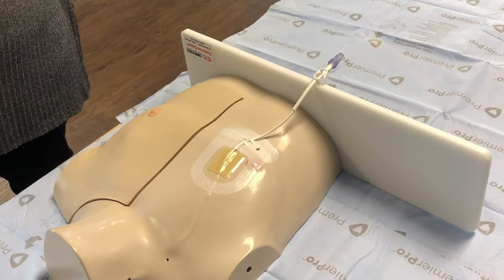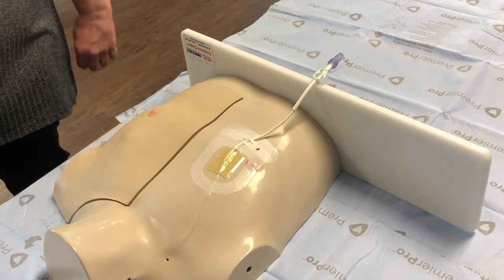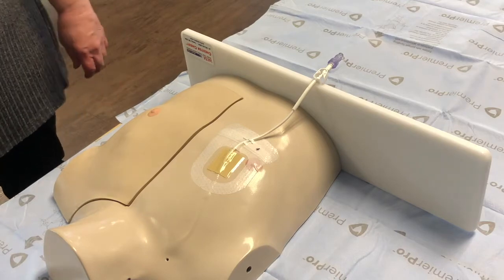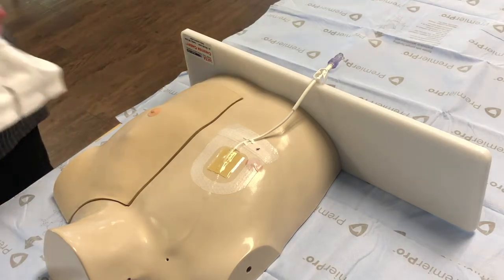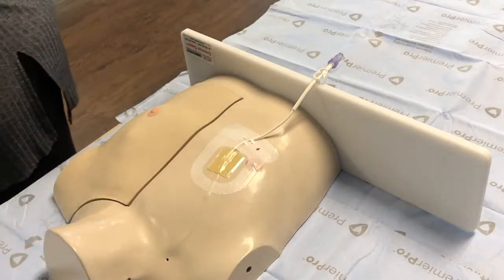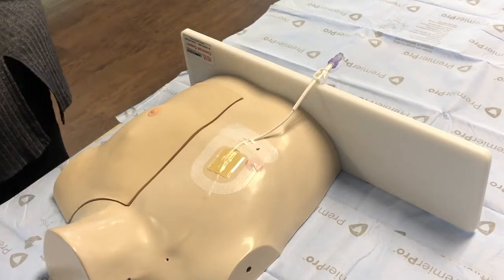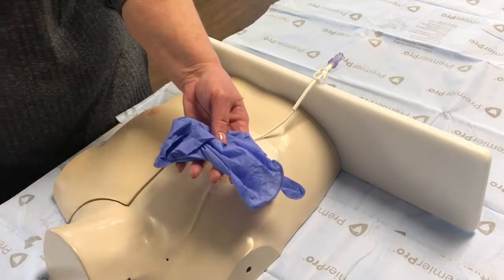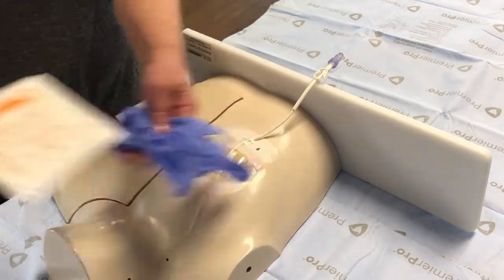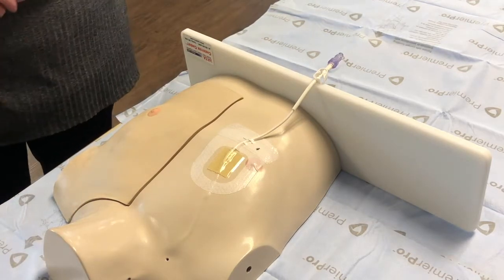This is a demonstration for removal and application of the central line dressing kit. The equipment that you'll need to perform the central line dressing change includes dressing kit, extra chlorhexidine cleansing swab, extra clean and sterile gloves, and extra masks for any family members who will be staying in the room.